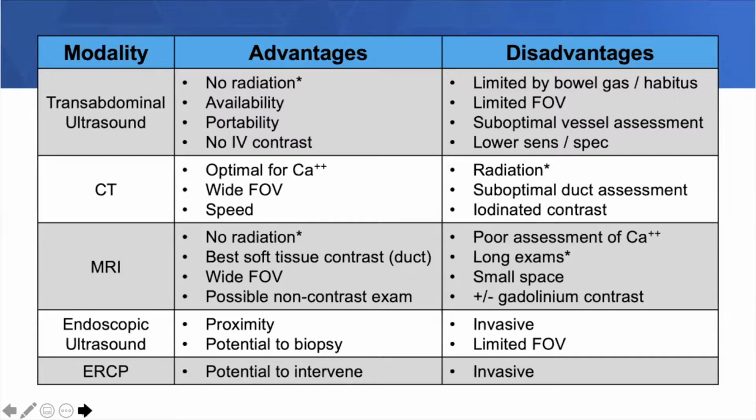So just in general terms, ultrasound is highly available and it's portable. It's very non-invasive. You don't need an IV. You don't have the radiation associated with it.